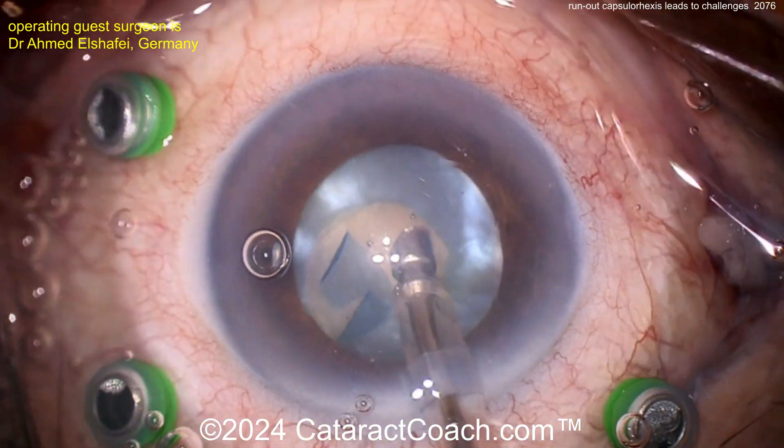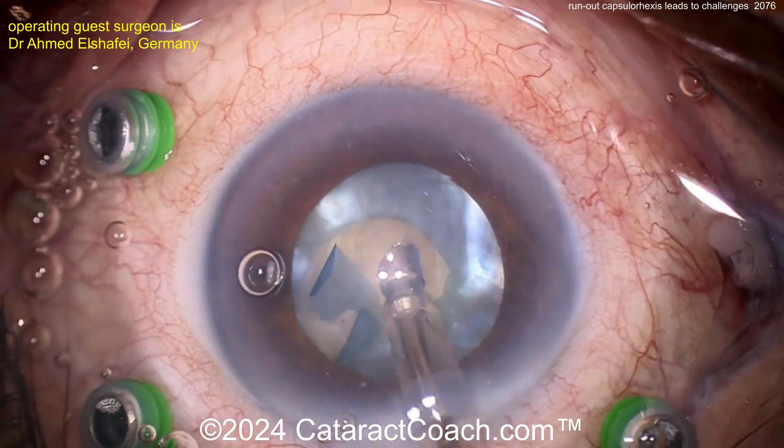Now the phaco probe is going in — that's a reasonable idea to decompress and get out some more of that intumescent lens fluid.